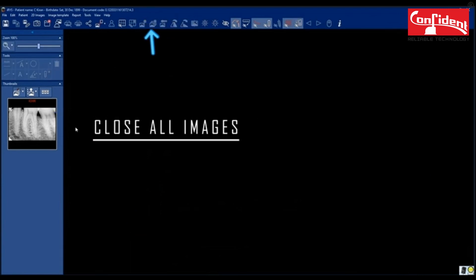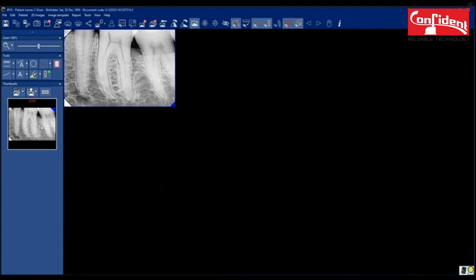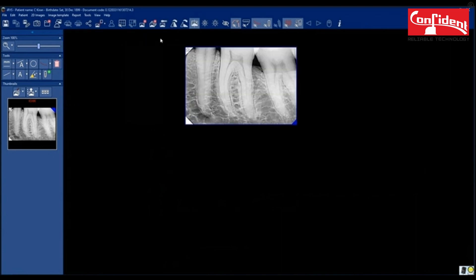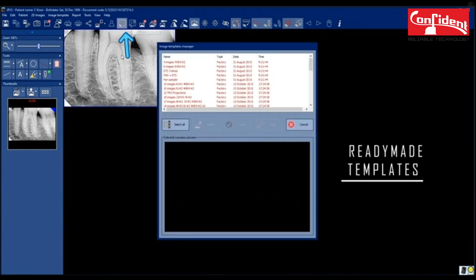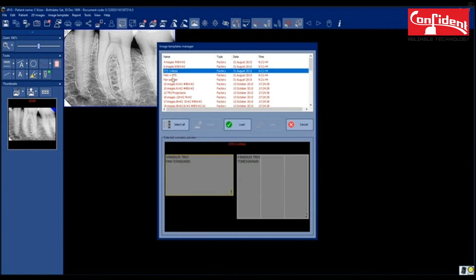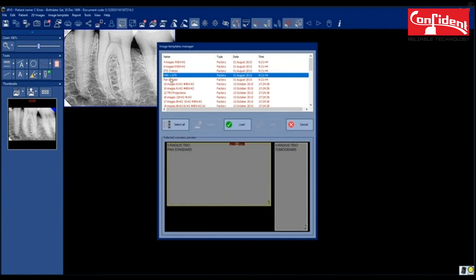Click here to close all images. Double click on the same icon to show them. Select a ready-made template for your images. You will find lot of options to select.